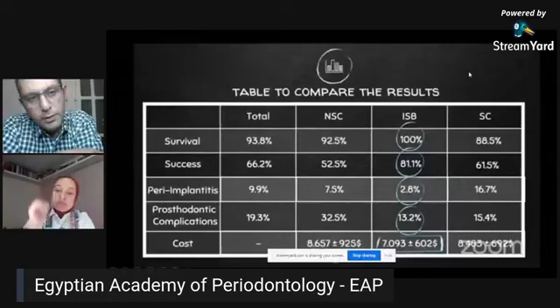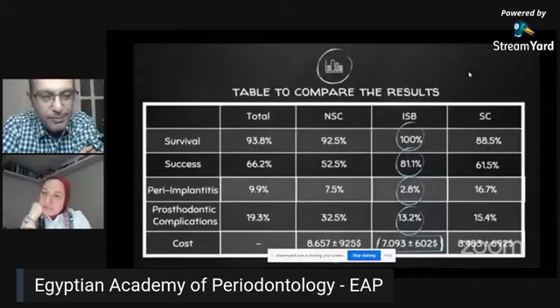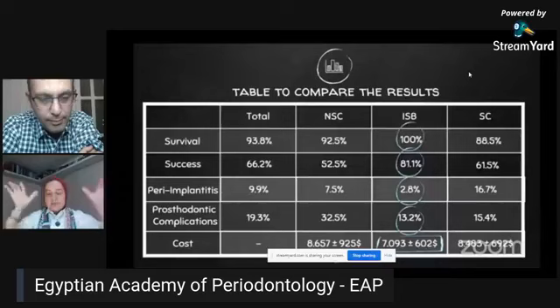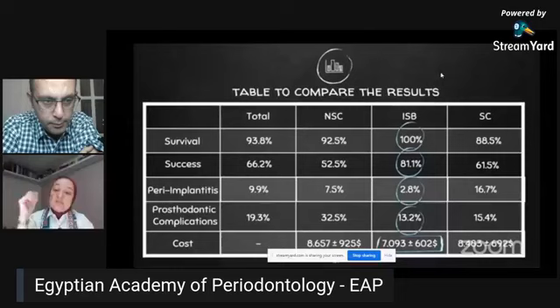This study is telling us that implants like to be far from each other. Yes, exactly. And their justification was that in spite of the bridge having bendability, it's moving because it's a bridge. At the end of the day, it's not a single crown. So in spite of this bendability, we had better results because we had less rough surfaces. This was their highlight conclusion, that you have less rough surfaces, and that if you put three neighboring implants, the middle implant is the most at risk of developing peri-implantitis due to the rough surface and the threads of the implant.